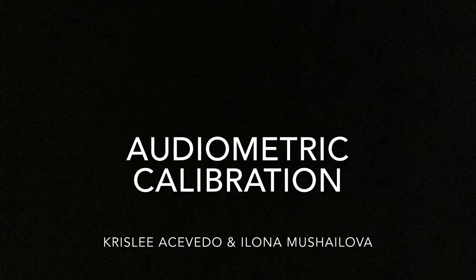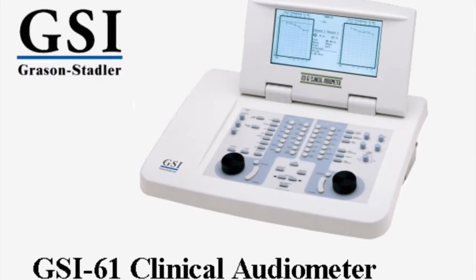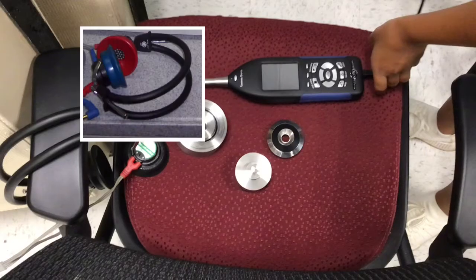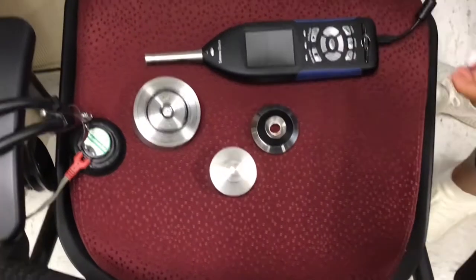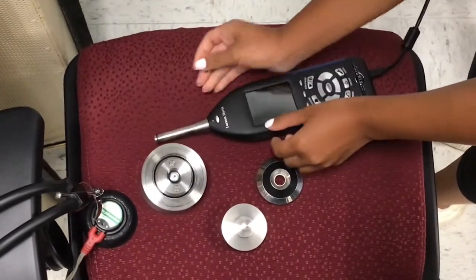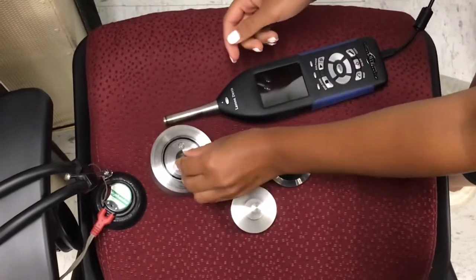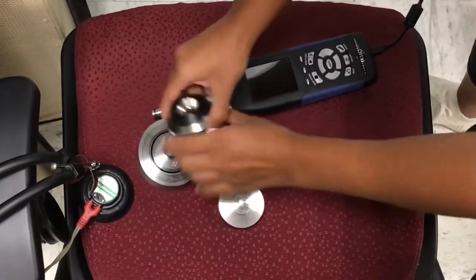In this audiometric calibration lab, we will be using the GSI-61 clinical audiometer. This is the setup. What I didn't record was that I detached the cup of the headphones from the band so that it is independent. Here, Alona is detaching the microphone of the SLM and putting it into the coupler. It sits inside, and then the coupler head is screwed on top.